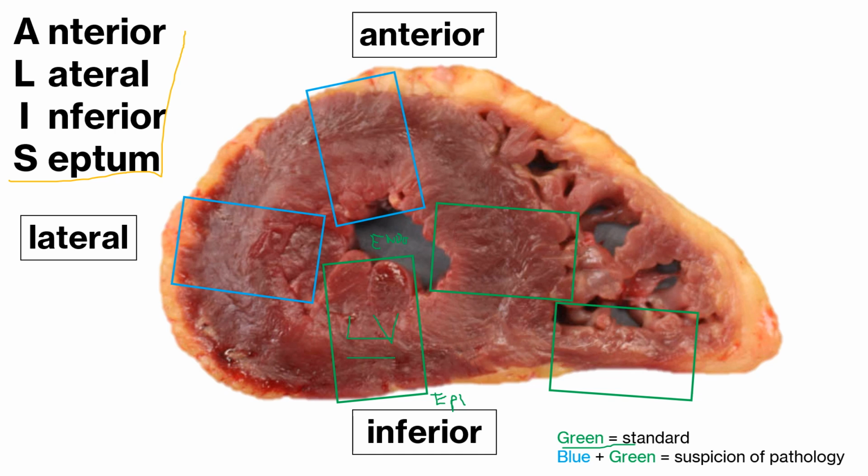Same thing for our septum here. We always take it within the middle. The closer we get to these transition zones, you'll more likely incidentally pick up what looks like naturally occurring myocardial disarray because we have two different patterns of muscle converging together. So we don't want to set off a false alarm. I take a nice one in the middle here.